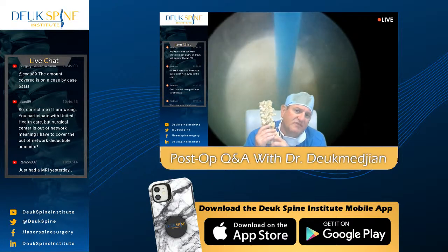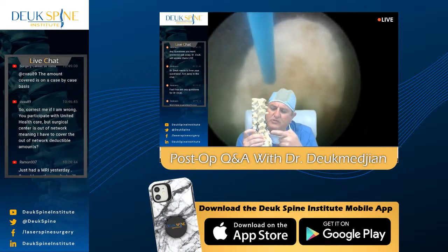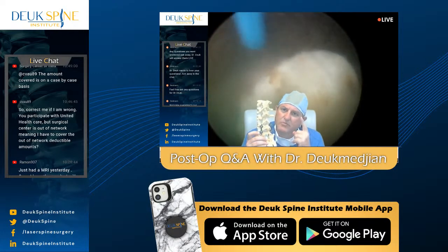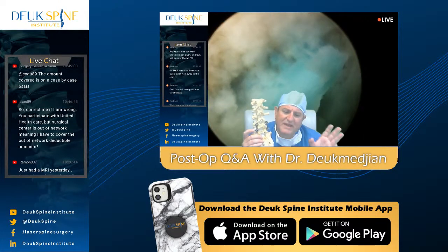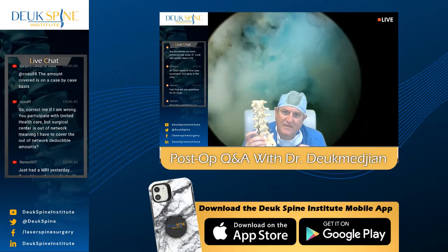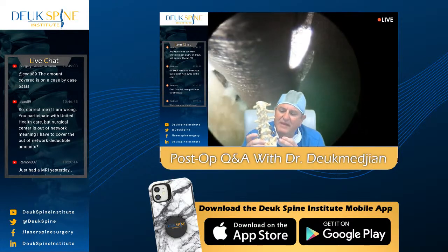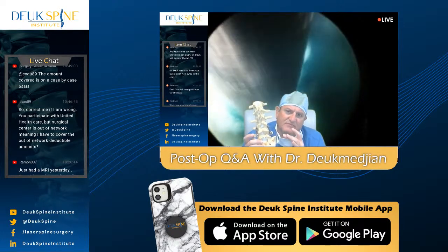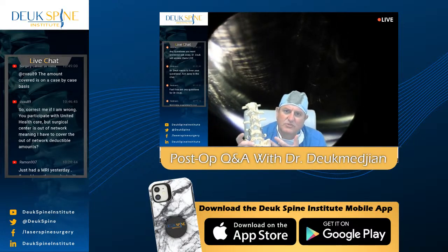So this patient we just finished, she had pain in an area that I mapped out to be L5-S1, L4-5, and L3-4. So I knew I was dealing with more than one painful disc, okay? I don't ever decide what surgery to do just based on the MRI unless the patient has one bad disc and it's obvious. Let's say they have a herniated disc at L5-S1 to one side, and they're having back pain at L5-S1 right at the belt, and the pain is going down their left leg, and they have a herniation on the left side, and all the other discs are normal. Well, now I can pretty much say the MRI is showing the actual source of pain.